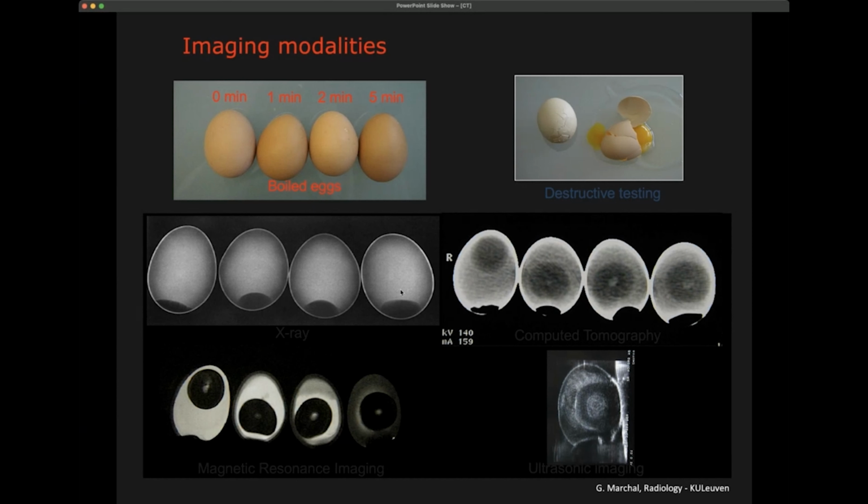So we have already covered a couple of modalities. Last class we did ultrasonic imaging, where you can nicely see that you get a very, very nice resolution in the direction of the scan line, which is horizontally in this case. And you see this very typical speckle pattern, which is because of the interference of backscattered ultrasound pulses. But a big disadvantage, as we said before, is that ultrasound is reflected fully at interfaces of gas, solid, or with liquids or with soft tissues.